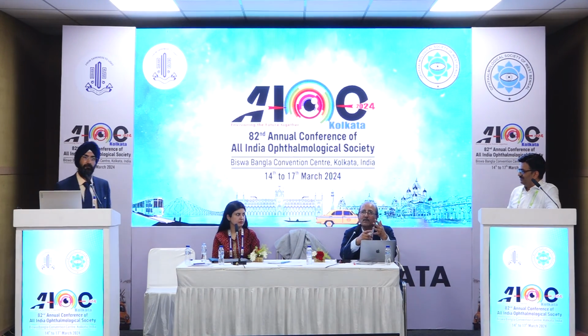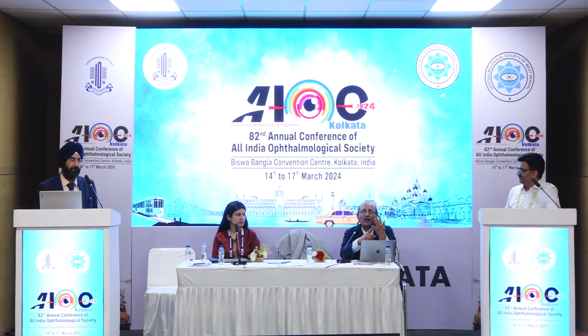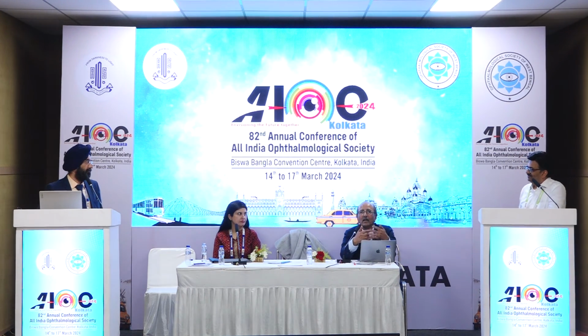Then we had a study from M.E. Wilson et al., and we showed that these four formulas, whether SRK/T, SRK II, Hoffer and others, have no significant difference in the outcome or in the refractive error. But after SRK II we shifted to SRK/T, and even Barrett at present. So we have to see which is the best.